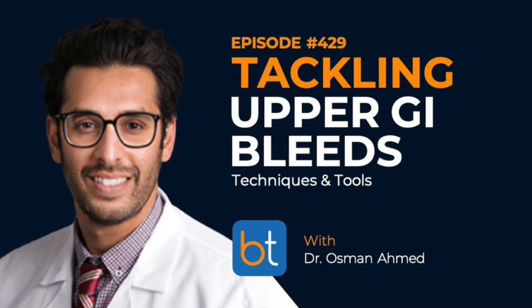Yeah, totally. I think especially for upper GI bleed, that pathway is pretty set in stone in that GI is typically consulted for an endoscopy. Now, rarely you will get somebody who has hematochezia or something like that, where they think it's a lower GI bleed and contact IR first, maybe even get a CTA. But more often than not, these patients are coming after GI has done some sort of scope and then called you to let you know what they found and were unable to control that bleeding.